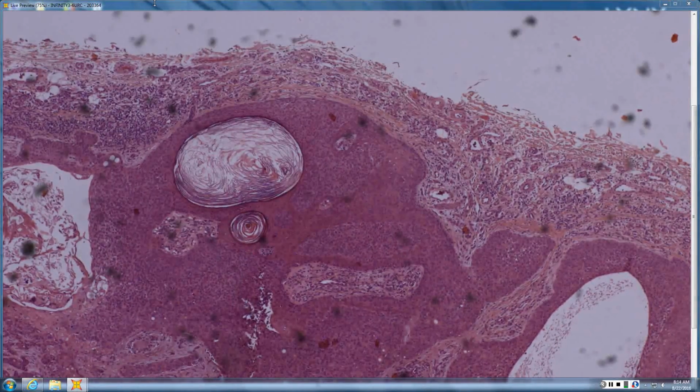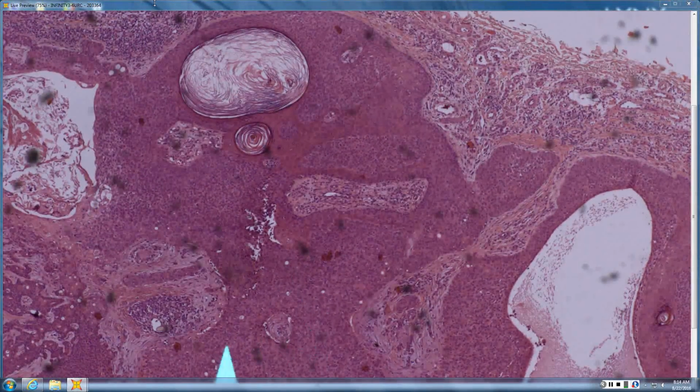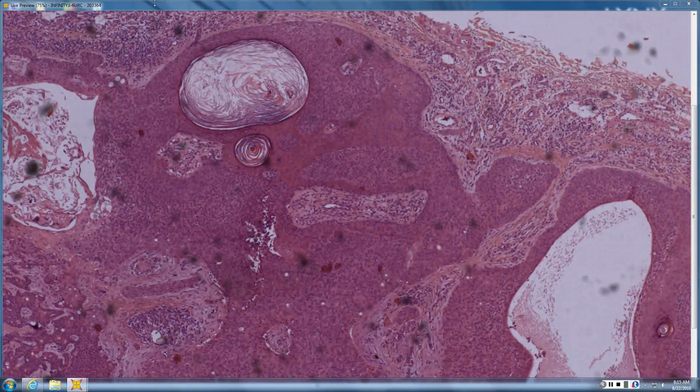So is it a clonal seb? Probably not, given that there are ducts about every 2 inches, right? But it shows you there's a lot of overlap, and most of the time, unless the ducts really hit you in the face, it wouldn't be fair to ask you the difference between a clonal seb and an acrospiroma. You'd have to have very obvious duct formation for that to be a fair question.